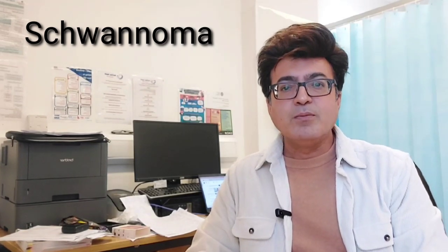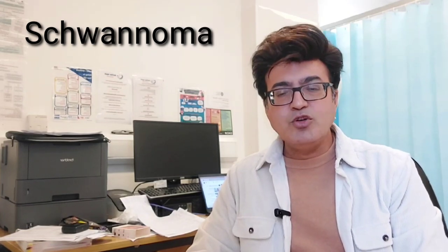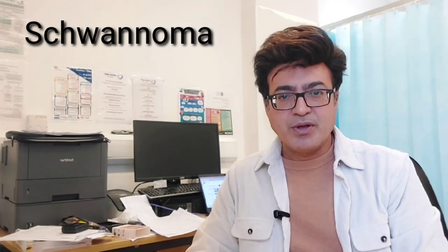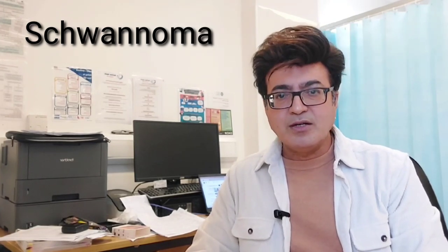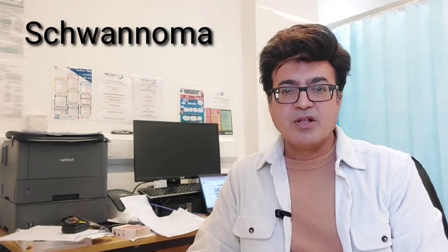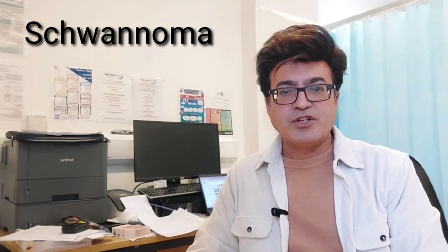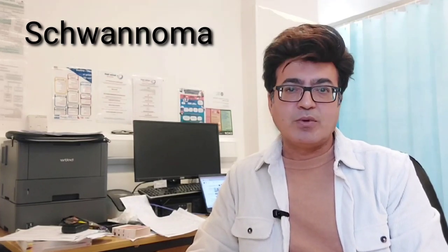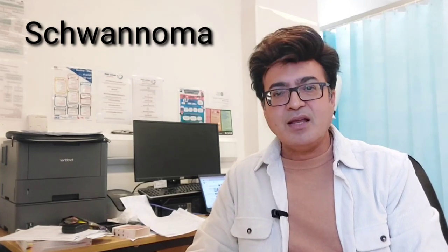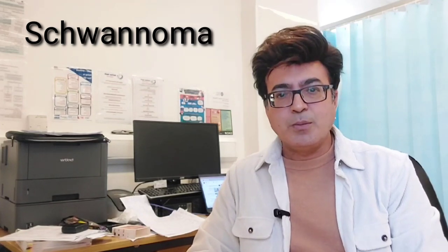So the one most important thing is acoustic neuroma. Acoustic neuroma is the tumor which involves cranial nerve number 8, the vestibulocochlear nerve, and that is the superior division of the vestibulocochlear nerve. For the detection of the vestibular schwannoma, it is recommended that MR is the best modality. And the second thing is it expands the internal auditory meatus.